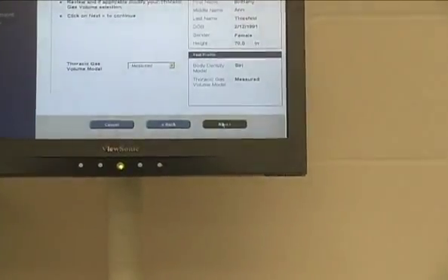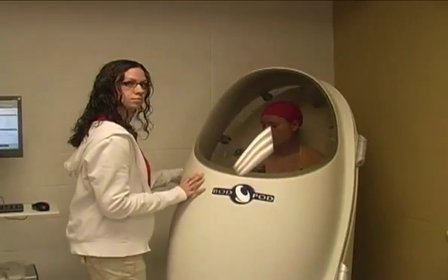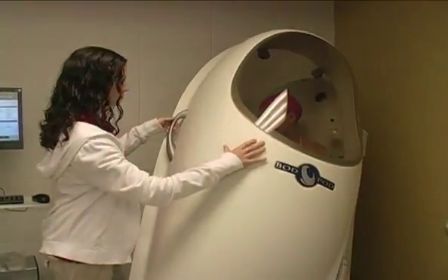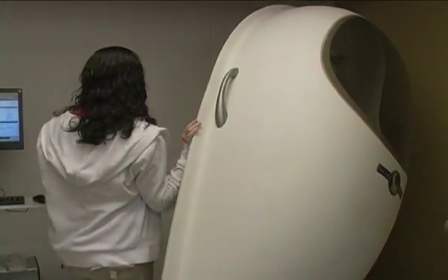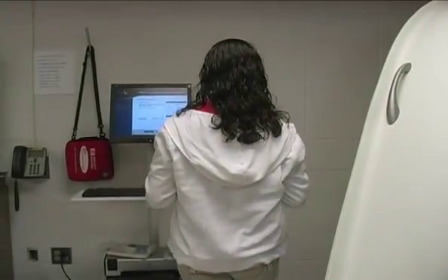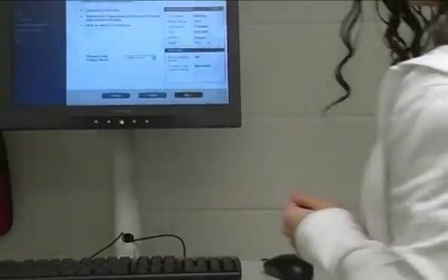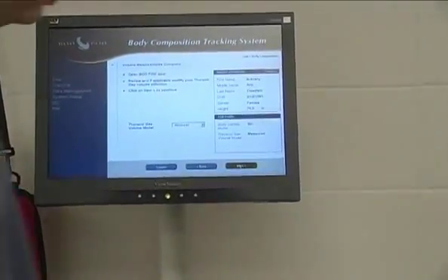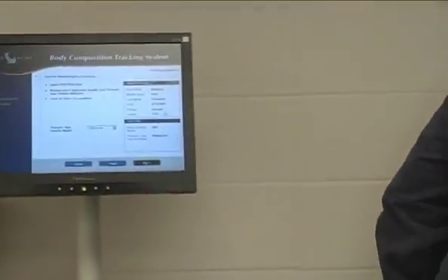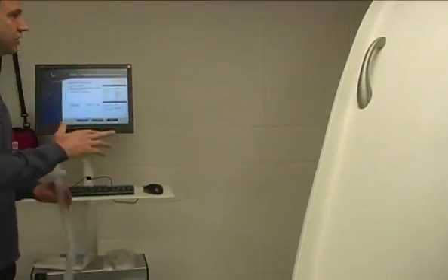Okay, so open the BOD pod door, and this is the part where it says review the thoracic gas volume if necessary. So we're going to do that because this is the first time we're doing it. So this is where the tube and filter are going to come in handy. Typically, what I do to enhance compliance if it's the first time is I take the tube and filter off, and I simulate what Brittany can expect while she's in the BOD pod.